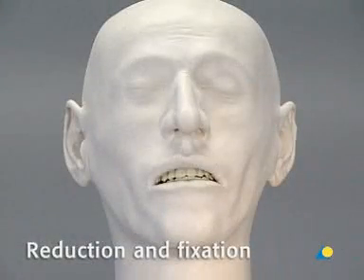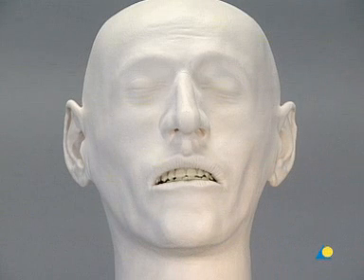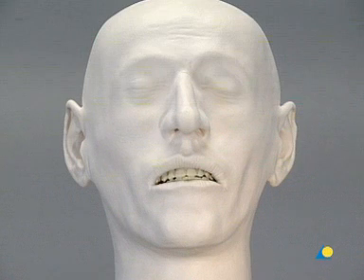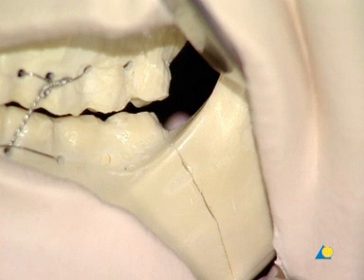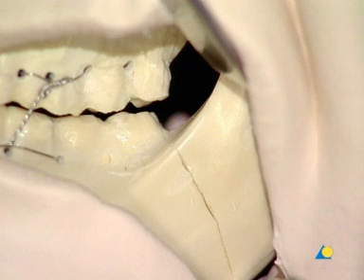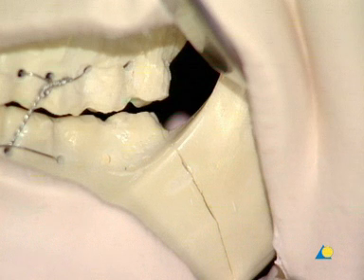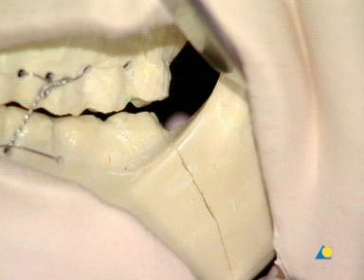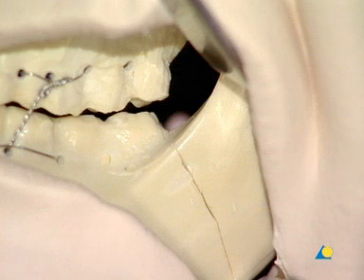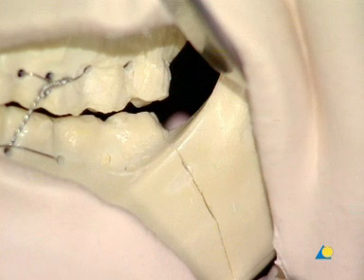When working on a model with a simulated skin cover, surgical gloves are recommended to reduce the risk of an allergic reaction. Open reduction and stable internal fixation in the dentate patient begins with fixation of the occlusion. Ernst ligatures have been selected; however, it should be noted that many surgeons prefer MMF with arch bars because of the increased stability.